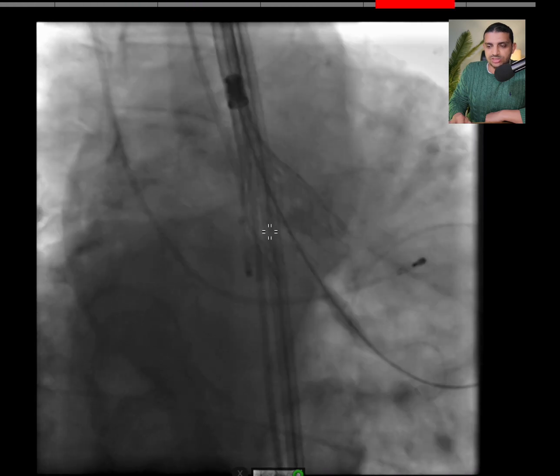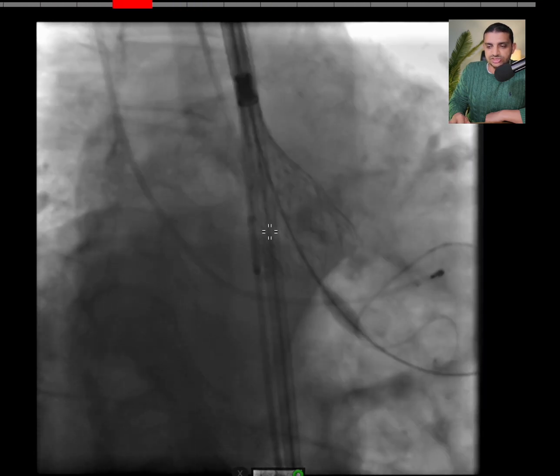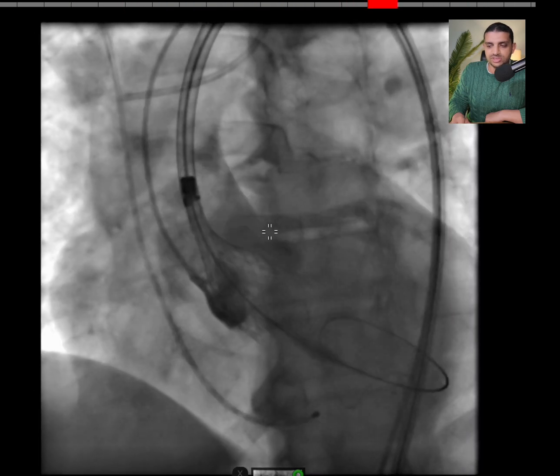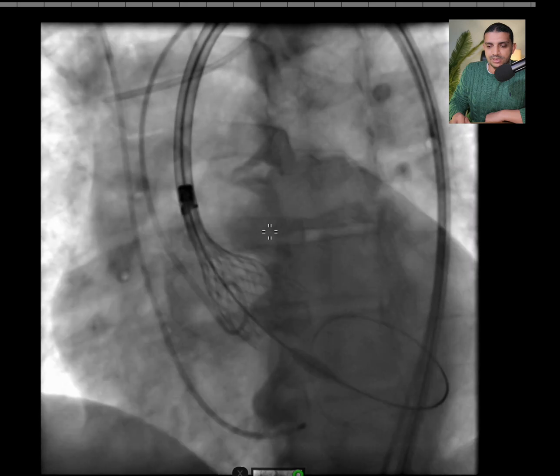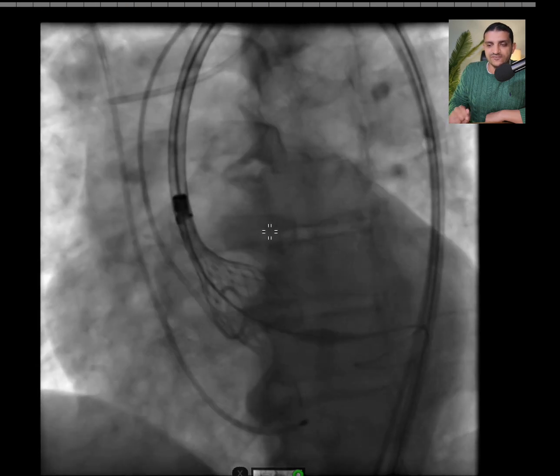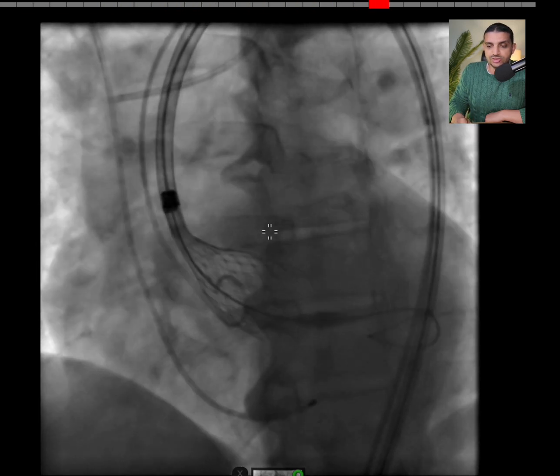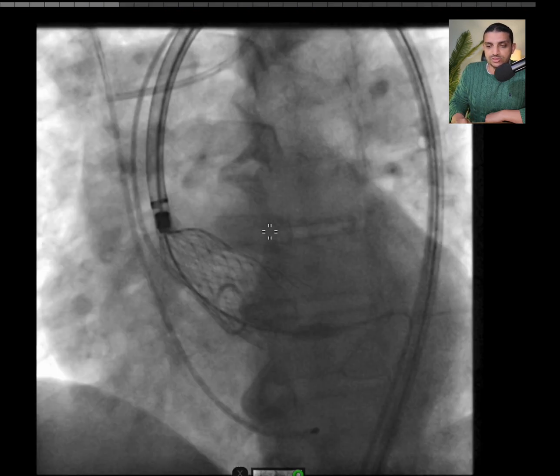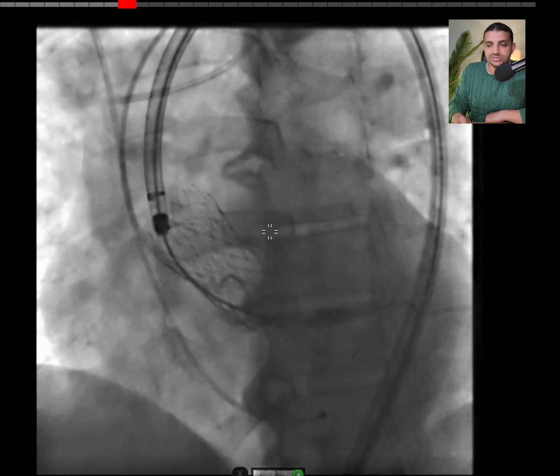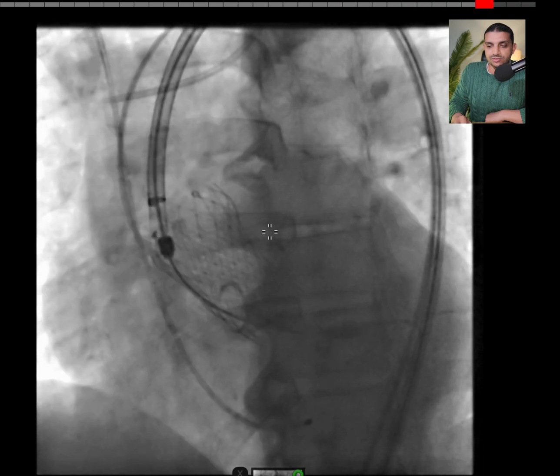Once I'm sure that this is the level that I want, I make a check injection — there is no parallax. In the coplanar view, this is a good depth. I start to release slowly with full maintained forward pressure. As you can see, it now turns into the outer curvature of the aorta, and I'm releasing it slowly, making sure that all the valve is released and unsheathed.